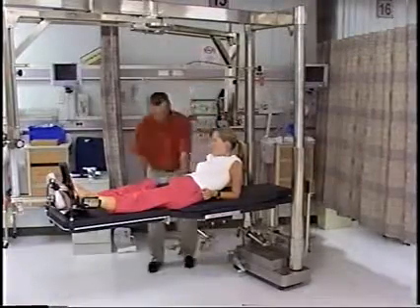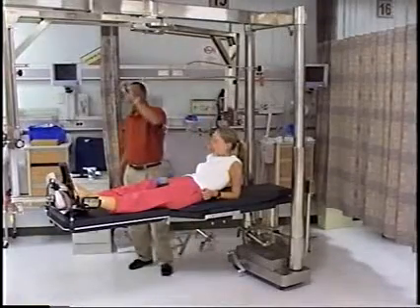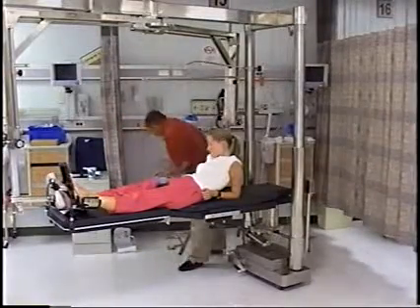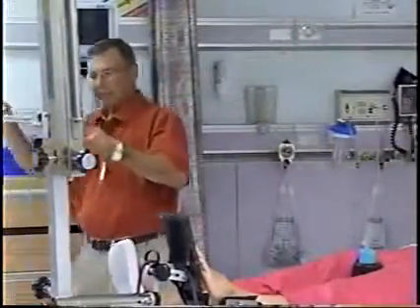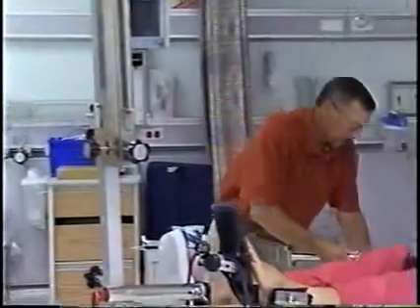On the side rail that we put on, we're going to attach a standard swivel clamp. You've got these laying around your OR everywhere. Goes on here. This is called an articulating bracket. And you will see when we put it on that we can do a figure eight with it. We can articulate it any way we wish.